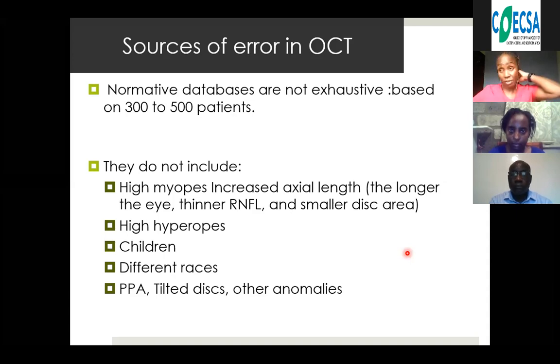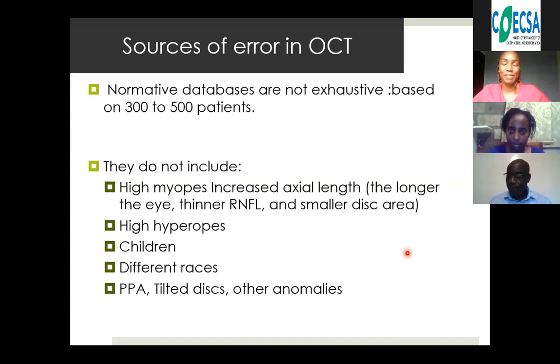You find that if you really have to do an OCT on a child, and you want some comparison of sorts, you have to indicate that the patient is 18 years, so that you can have some sort of printout that will compare with what is in the database, because the cutoff for most machines is 18 years. As I said, we have different races.